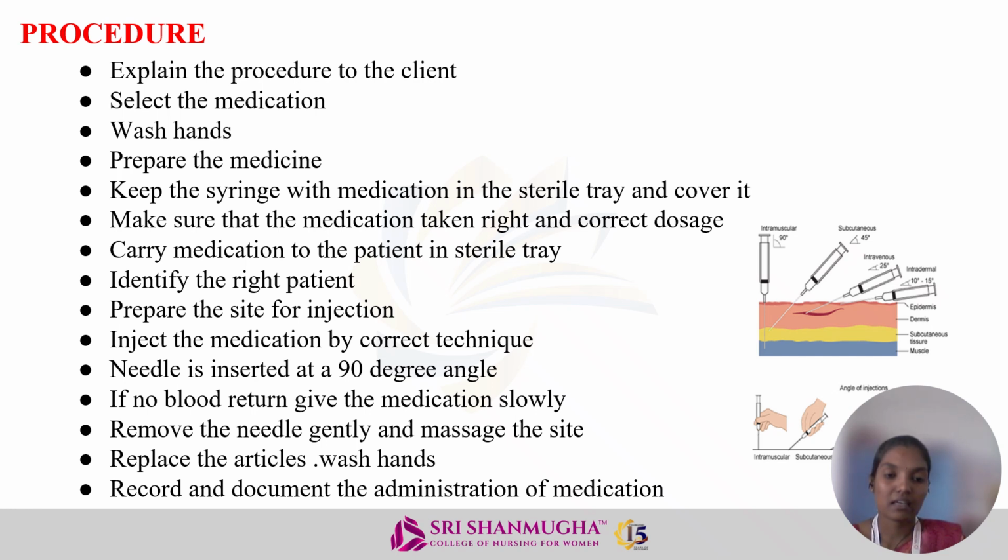The needle is inserted at a 90-degree angle. While administering the IM, we have to administer at a 90-degree angle. If blood is not returned, we have to administer the medication slowly. After that, remove the needle and gently massage the site. After that, replace the articles.